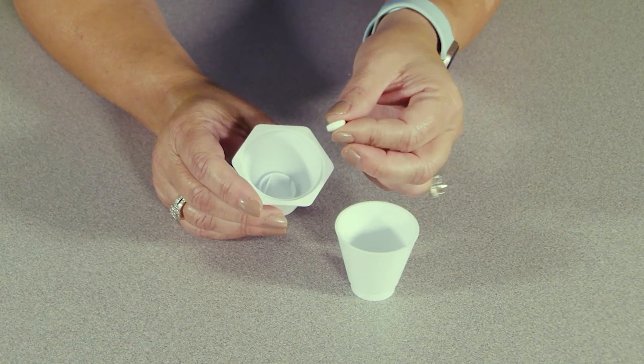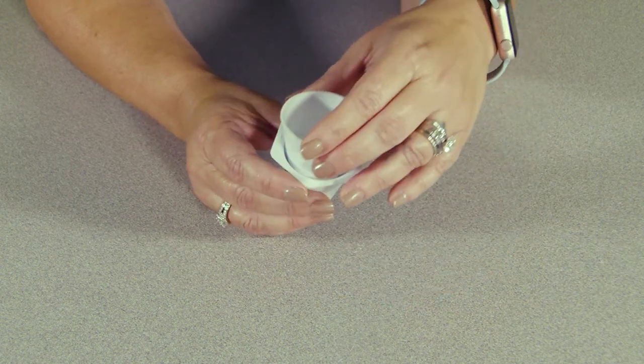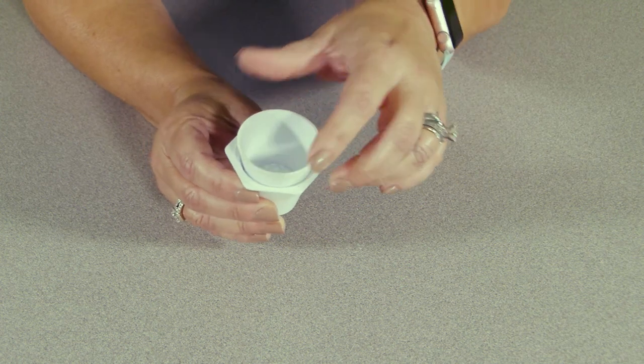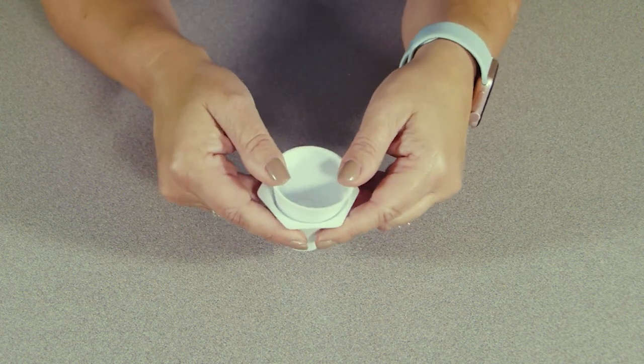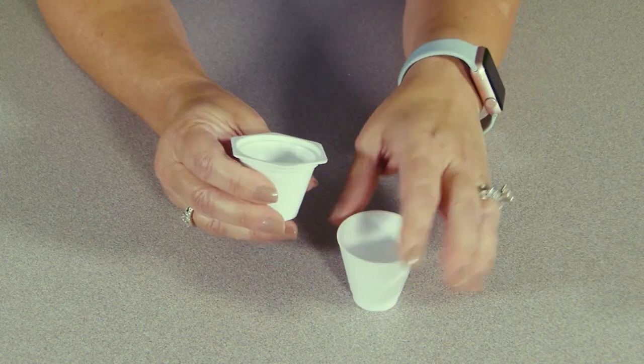As you can see, I just dropped the tablet into the diamond-shaped area of the cutter. Next, I take the top cup, place it inside, and rotate until the grooves align. Then I push down like this to cut the tablet in half. A clean cut!